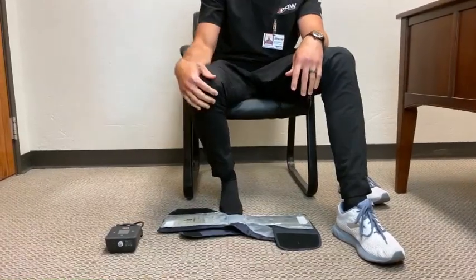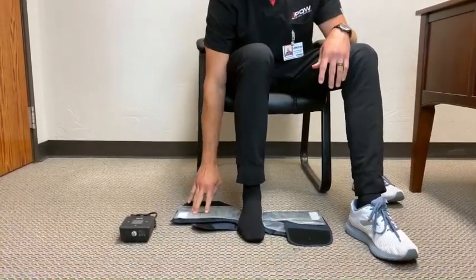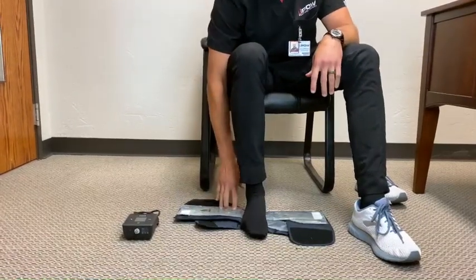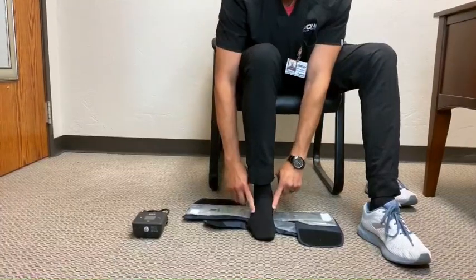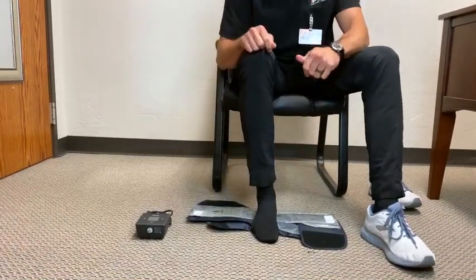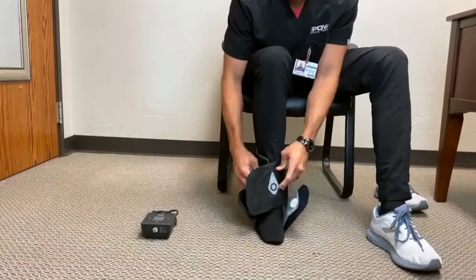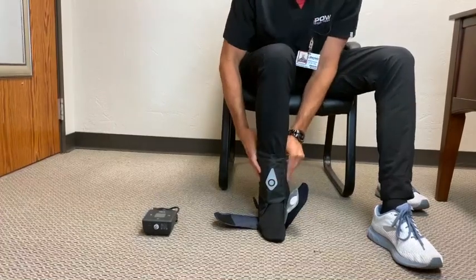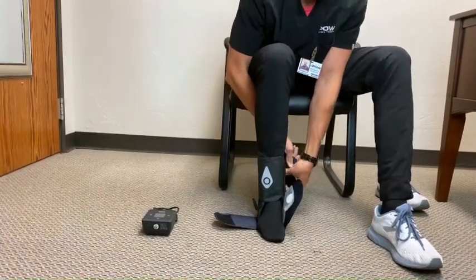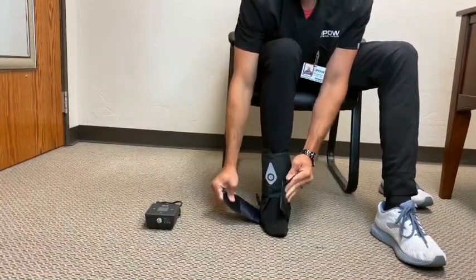Place your foot, wearing a sock, in the center of the wrap with the writing on the right side of the foot and the heel at the back edge of the wrap. If possible, keep your knee and ankle aligned at right angles. Pull the straps on each side of your foot and up towards the knee. Wrap the strap with the Squid Go logo around your shin and fasten. Fasten the back strap around your calf. Connect the foot straps across the top of your foot and adjust the wrap to fit snugly around your foot.